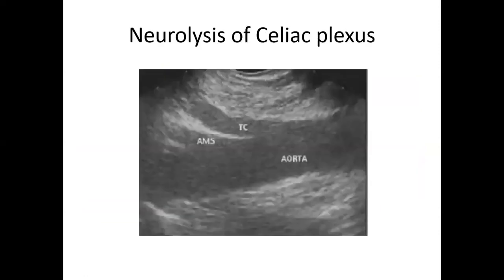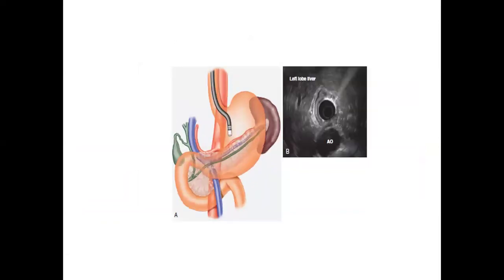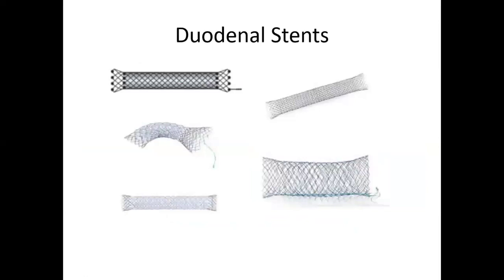Let me see if I can see an image. So if this patient, for example, has a partial blockage here, we can push in a stent here and open up so that things can pass. We usually use this approach when giving palliative care to patients with advanced cancers. So we can insert these stents.